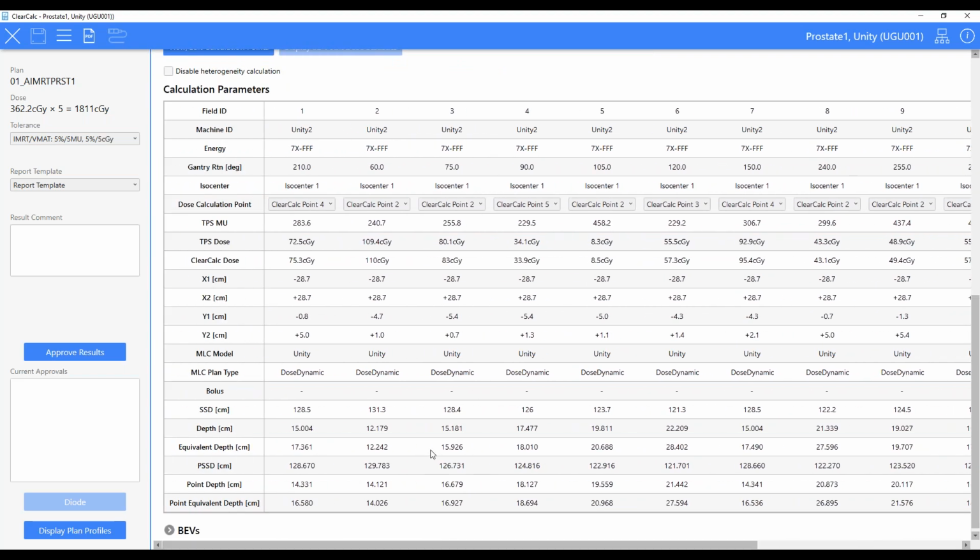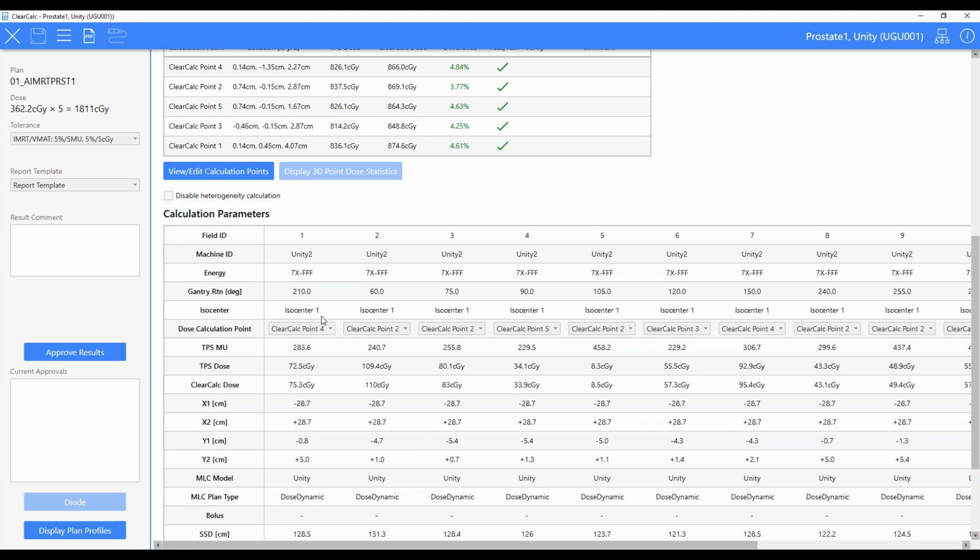So it really looks similar as far as the interface. A few things got taken off that don't apply for the machine itself, but it will largely function the way you're used to seeing on the other photon related plans.